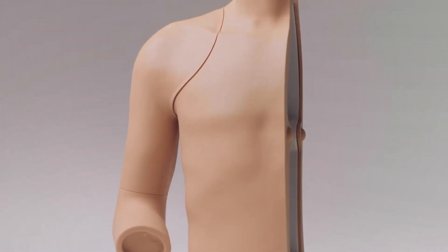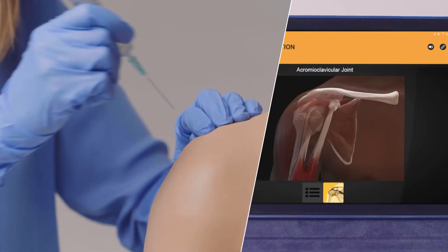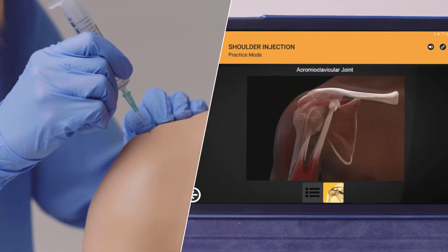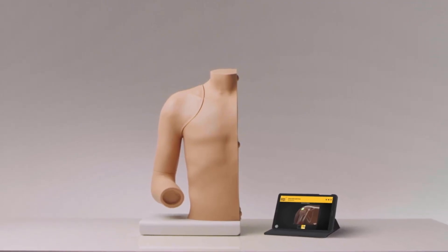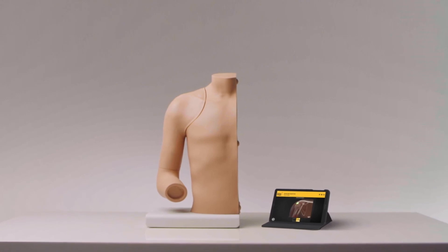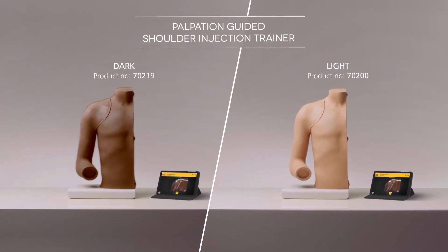The Limbs and Things Palpation-Guided Shoulder Injection Trainer combines physical practice with the guidance of technology. It provides repeatable training that can help improve trainee confidence, accuracy of injections, and patient outcomes.